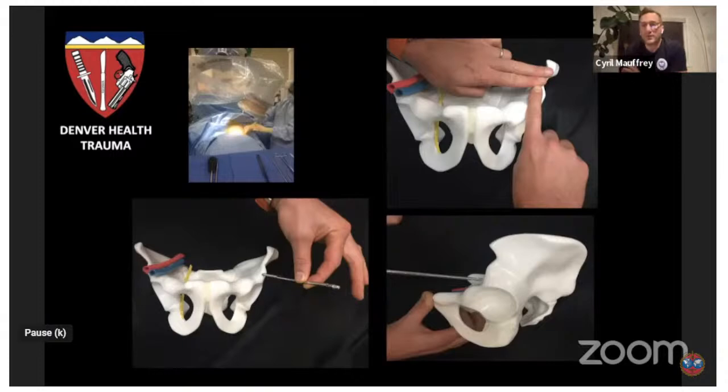I disagree with this statement. And in fact, we published a paper with Peter Jannuzzi on the fact that this view is not useful. When you do a femoral nail, you don't get a view of the tunnel of the femur to get your entry point. You get two orthogonal views, right? And this is exactly the same. Therefore, the obturator outlet that is used for supra-acetabular screws or LC2 is not useful. It's actually in your way.